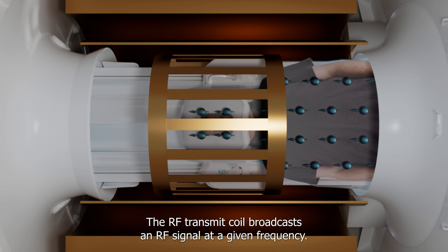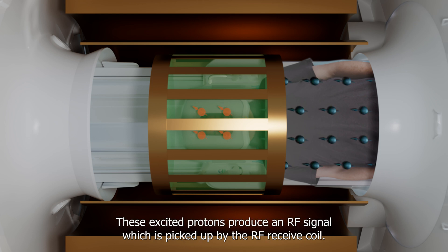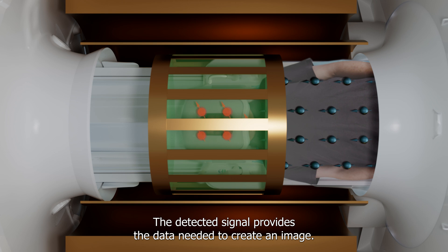The RF transmit coil broadcasts an RF signal at a given frequency. This is known as the resonance frequency. The targeted protons absorb the RF energy. These excited protons produce an RF signal which is picked up by the RF receive coil. The detected signal provides the data needed to create an image.